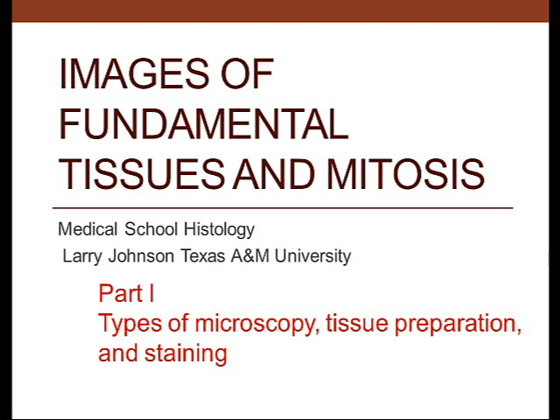Hi, this is Larry Johnson. I am a professor at Texas A&M University, and today we're going to talk about the images associated with the fundamental tissues and mitosis, which is the first medical school laboratory we have in histology.